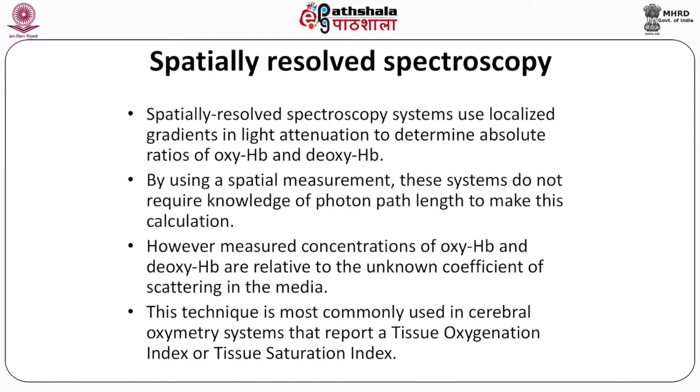By using spatial measurements, these systems do not require knowledge of the photon path length to make this calculation. This photon path length was required in the earlier techniques, but spatially resolved spectroscopy does not require knowledge of the photon path length. However, the measured concentrations of oxyhemoglobin and deoxyhemoglobin are relative to the unknown coefficient of scattering in the media, because we do not know the photon path length.